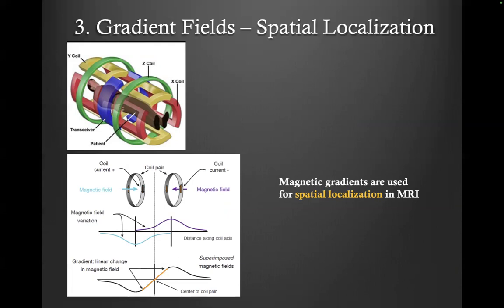And if you remember what I said, all these little nuclear spins are spinning inside a magnetic field. The speed of the spinning depends on the gyromagnetic ratio, which is tissue dependent, or rather, hydrogen dependent.